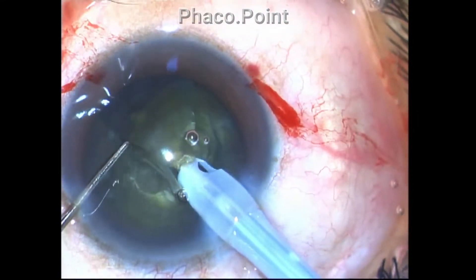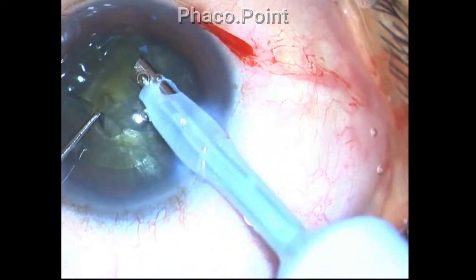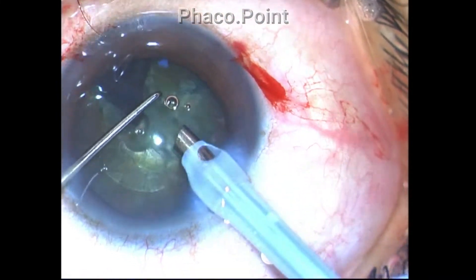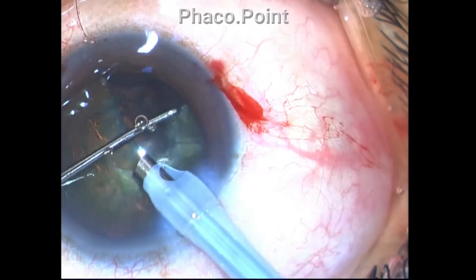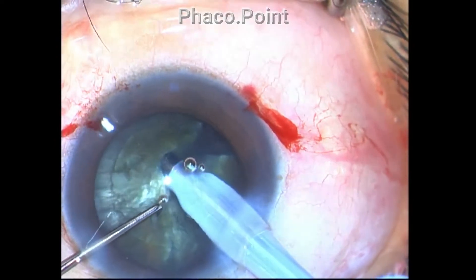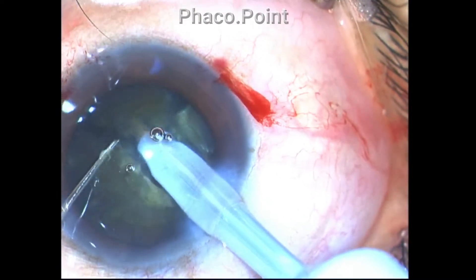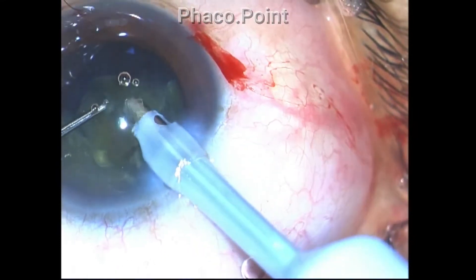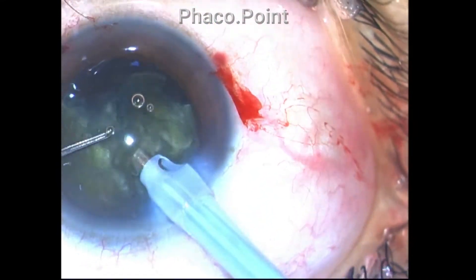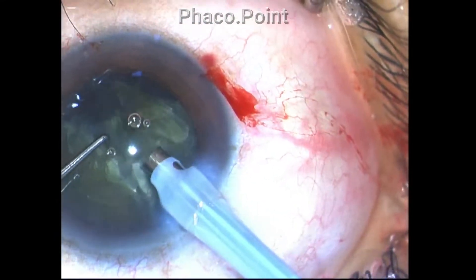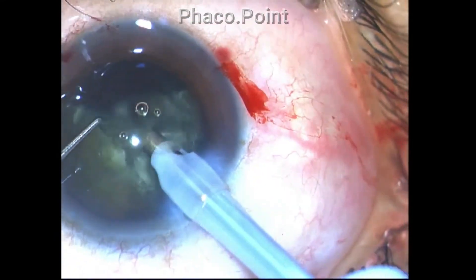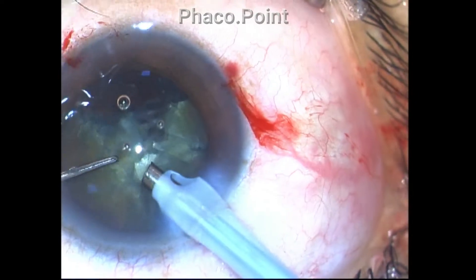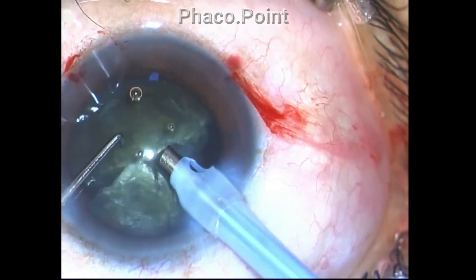The logic is: when you mobilize a small fragment, you have more control over the number of small pieces it will break up into. You can see how clean the anterior chamber is when I emulsify this fragment. I do not move to the next fragment until I have completely finished with this fragment — including the main section as well as the small subsidiary fragments released while downsizing. You have to address everything at one go and keep the anterior chamber clean.